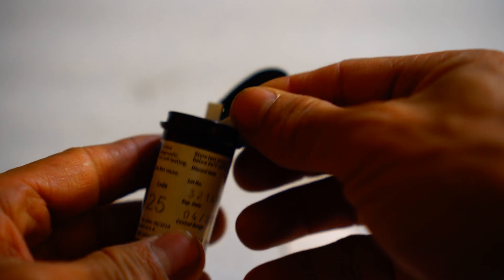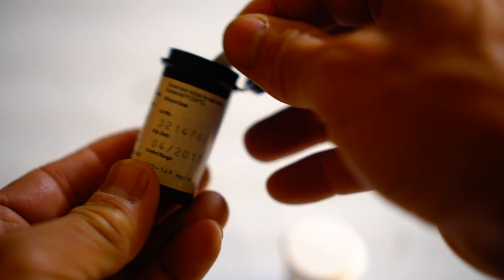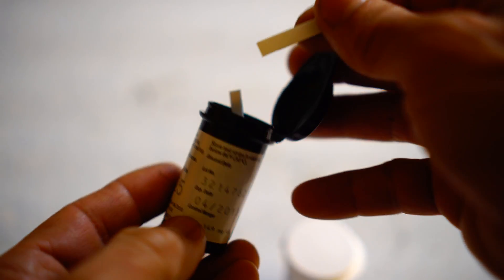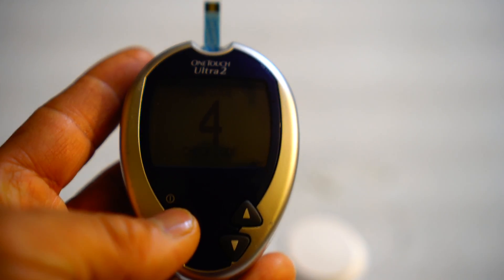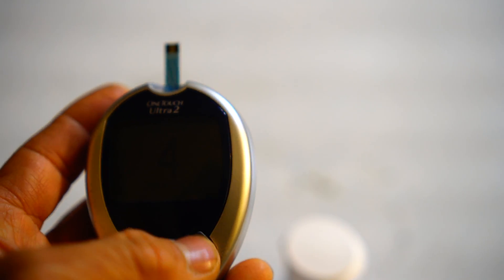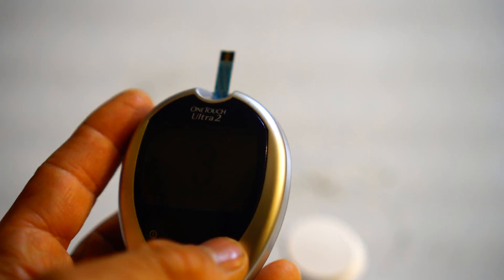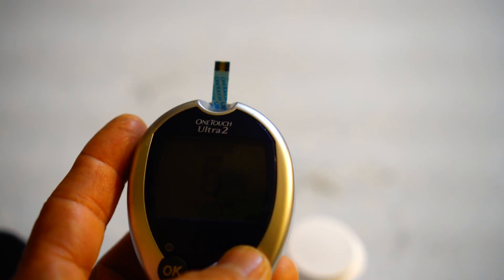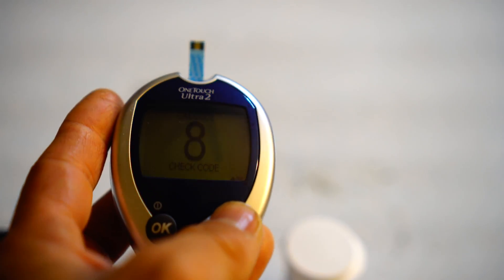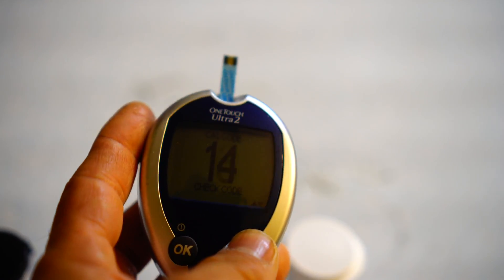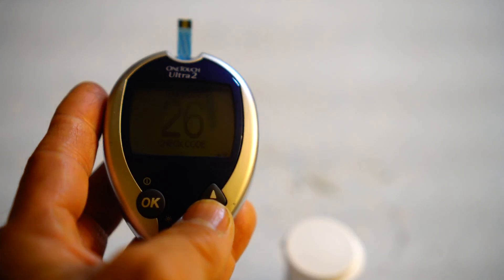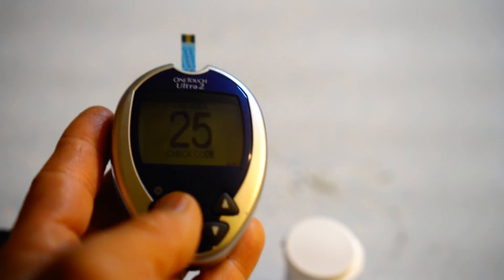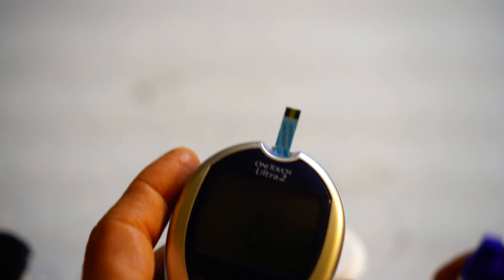Let me take it out of the vial so you can see. This is the strip that I got. We put it in here, and it's the wrong code—you need to go to code 25. Okay, then I'm going to put the control solution on this.